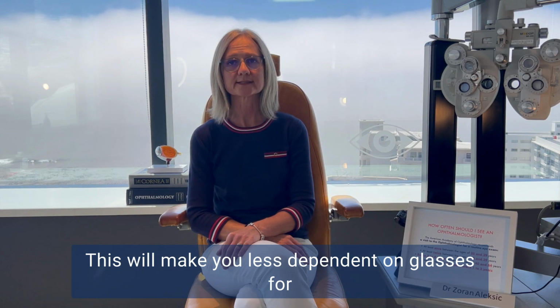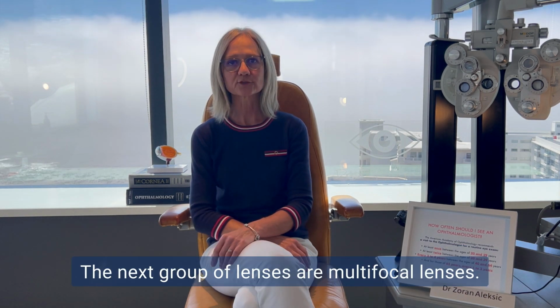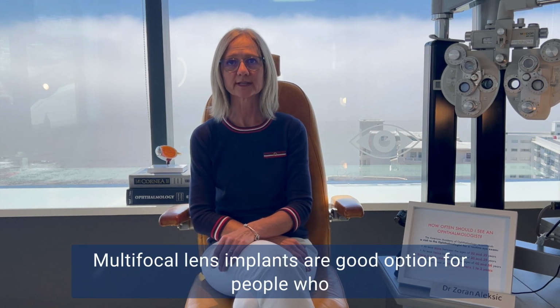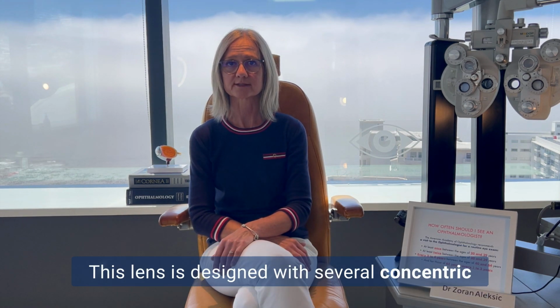This will make you less dependent on glasses for intermediate vision, like working on your computer, but you will still need to wear readers for close-up work. The next group of lenses are multifocal lenses. Multifocal lens implants are a good option for people who want to be less dependent on glasses altogether, for those who do not like wearing reading glasses.